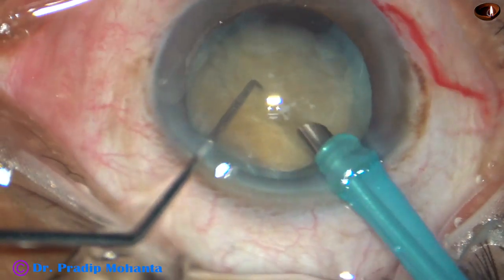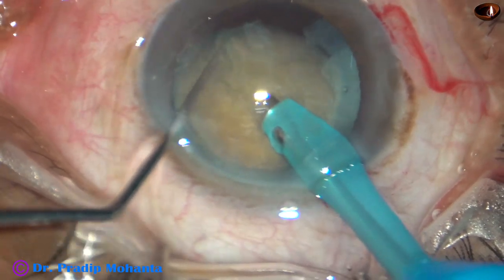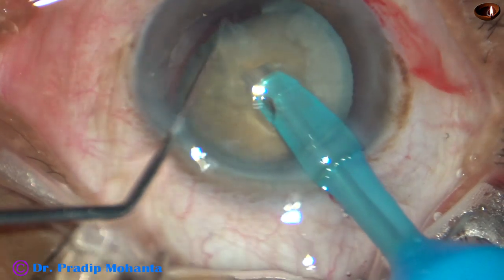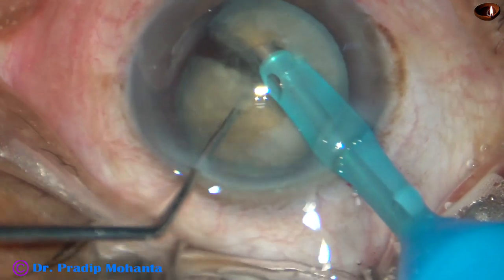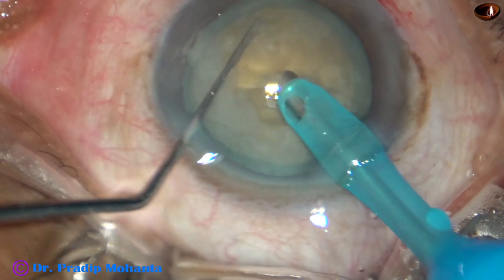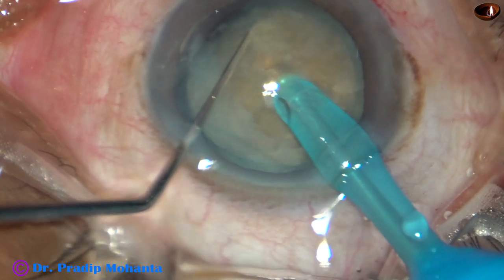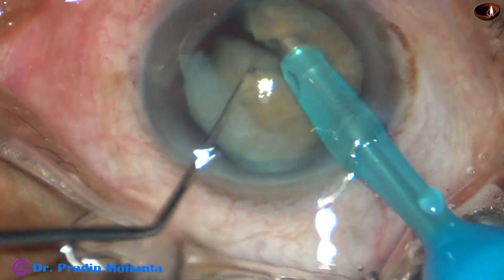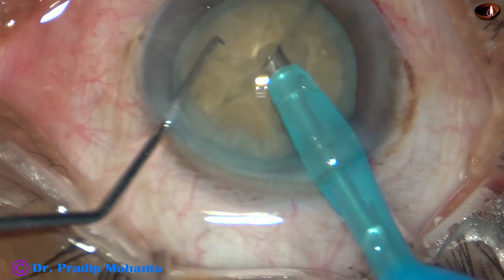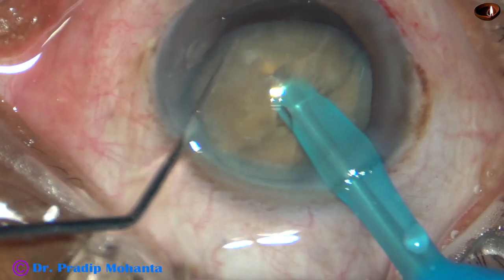But I could not chop the nucleus, so I make it bevel-up. Along the same track I go to the anterior extreme, and now I could chop the nucleus — a very nice chop. It's not from one side to the other side, but it's a nice crack. And now there is another crack. The two nuclear pieces are still joined to each other by some leathery lens fibers.